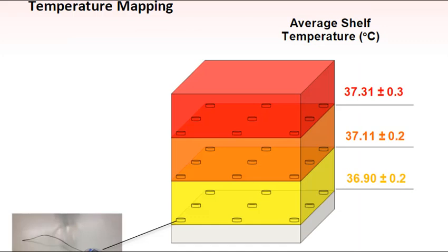Big box incubators have a great deal of variation within and between shelves, as shown in this figure. Higdon and colleagues also showed a significant difference in pregnancy rates and implantation rates after culture of embryos in different incubators of the same model and between shelves used in the same incubator. Laboratories would be well advised to understand the variation within their incubators both on and between shelves if using large or small box incubators with different shelves.